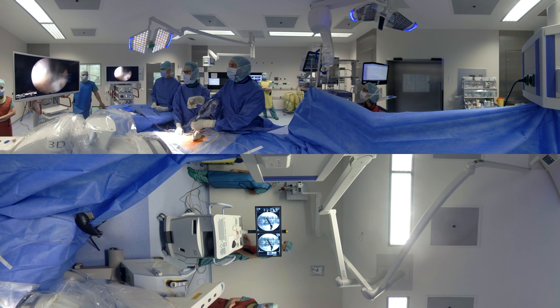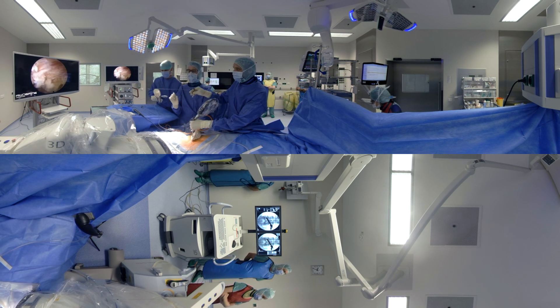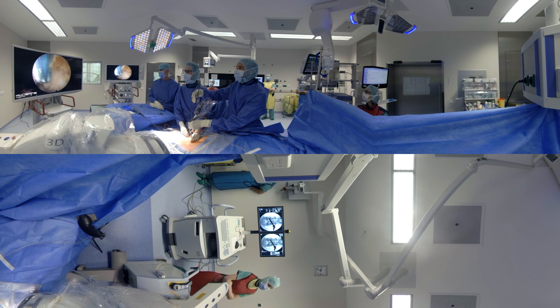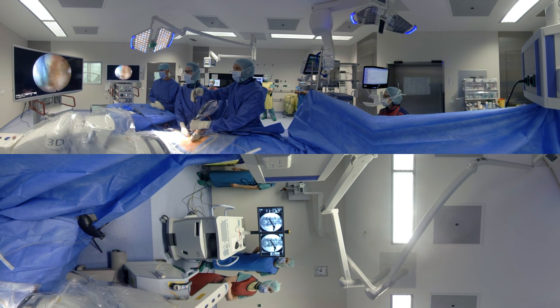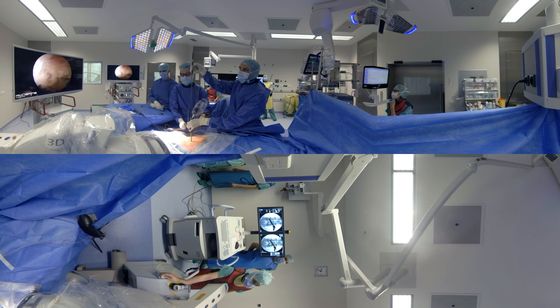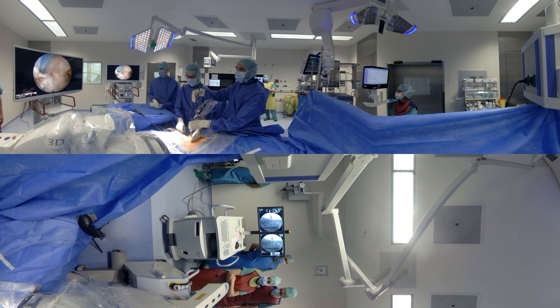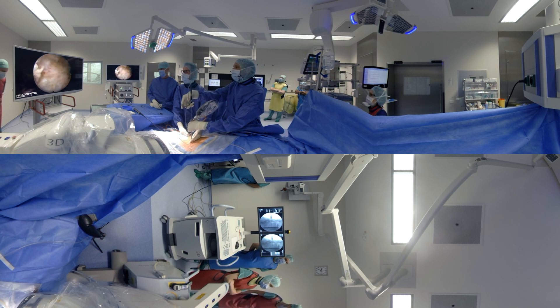From here on everything is under endoscopic visualization. Let's expose the interlaminar window. This is the bony structure — the facet joint — and we will have to widen our interlaminar window a little bit. This is very important at the level L4-5 so that once you are with your instruments in the spinal canal, you don't add any compression on the neural structures. There's yellow ligament here — this is cranial, there's the facet joint out here. We take one X-ray shot just to confirm we are working on the right trajectory.